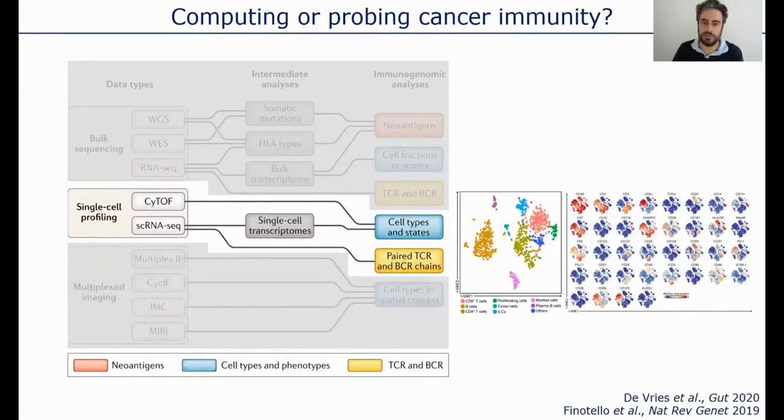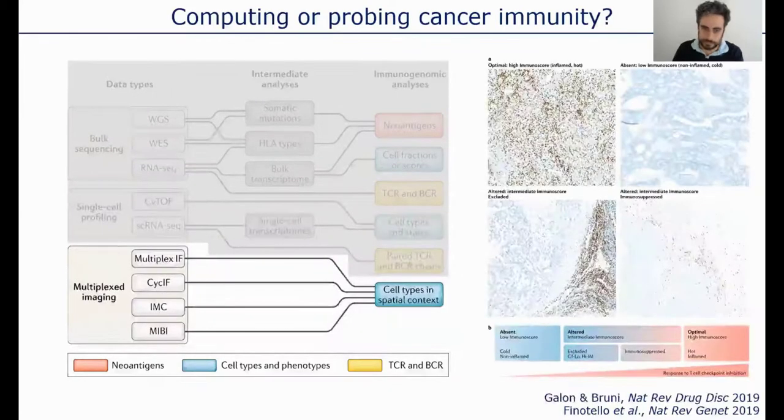associated to our ability to retrieve certain immune cell subsets from tissues. Particularly when we're talking about solid tumors, it can be quite challenging to retrieve all subsets that are contained within the tumor microenvironment. So to address these insufficiencies, it is fundamental that we can make use of multiplex imaging technologies that not only inform on the phenotype of the cell, but also their location within the tissue and the cellular context they're inserted in.